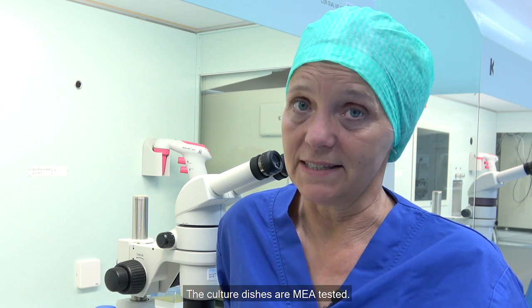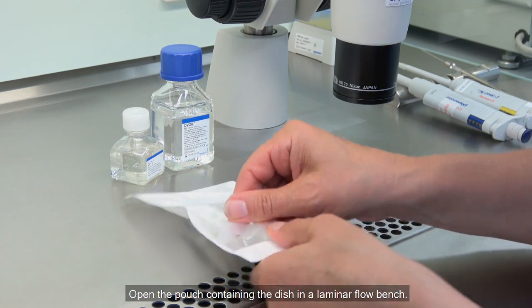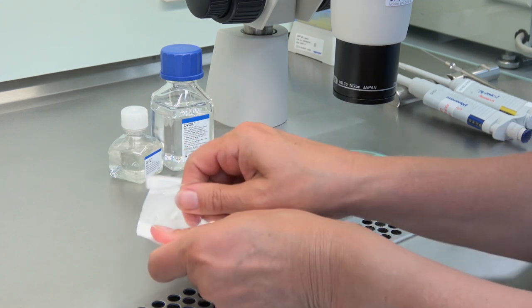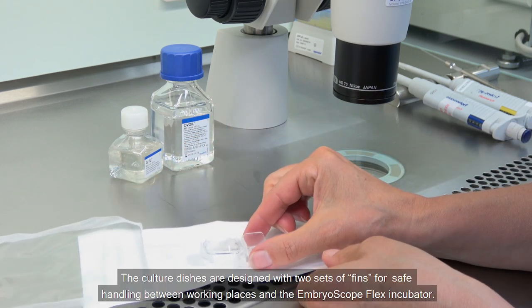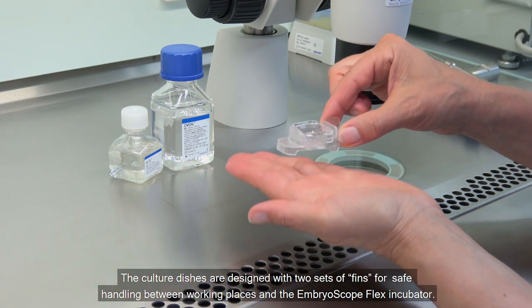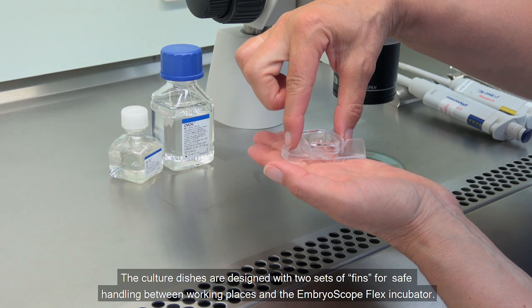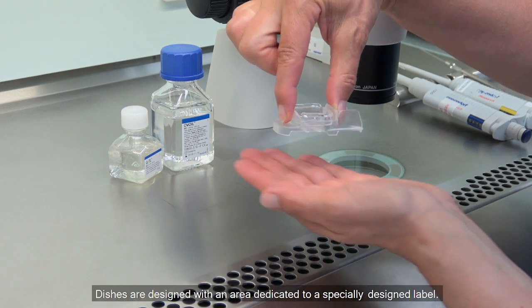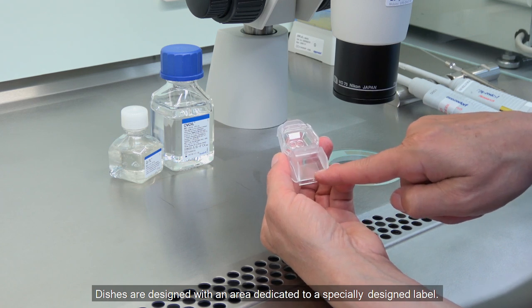The culture dishes are MEA tested. Open the pouch containing the dish in a laminar flow bench. The culture dishes are designed with two sets of fins for safe handling between working places and the EmbryoScope Flex incubator. Dishes are designed with an area dedicated to a specially designed label.